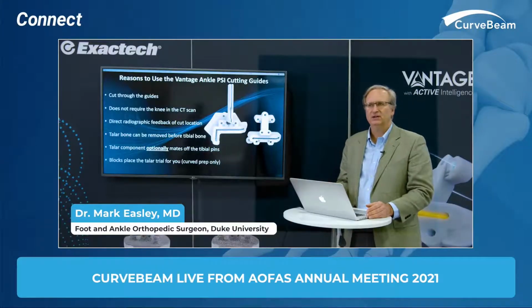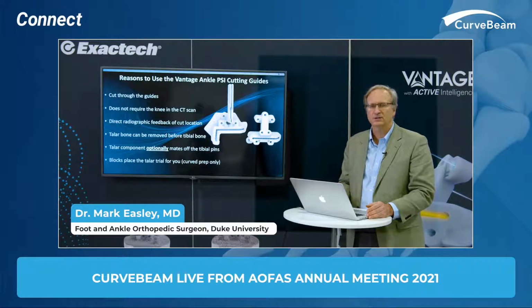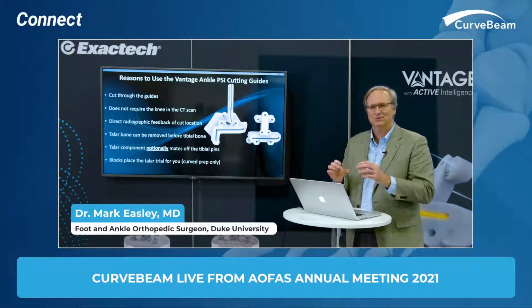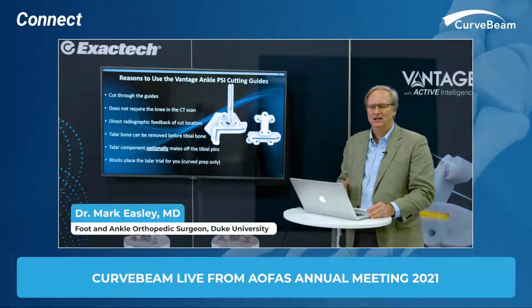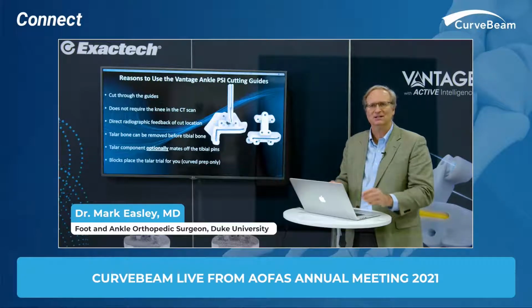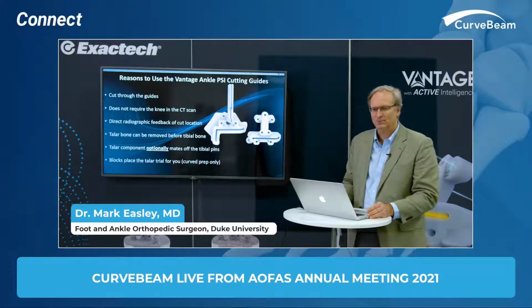What about the Vantage ankle system? I've been very proud, obviously I have a bias, but I'm very, very proud to work with this team. The reason the PSI is even more advanced is that other systems currently have instrumentation that allows you to create a cut guide position, but then that has to be removed and a cut guide placed in its place. The newer technology, including what Vantage has worked out with 3D Systems, is to have a block that is planned, put on, pinned in place, and that is in itself the cut guide as well. So I think that's really important.